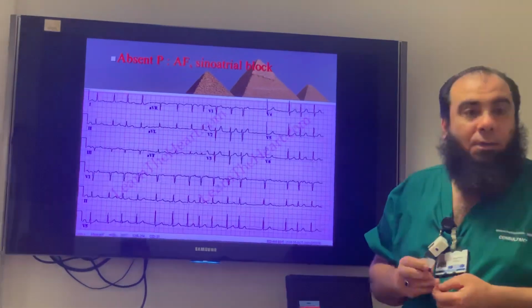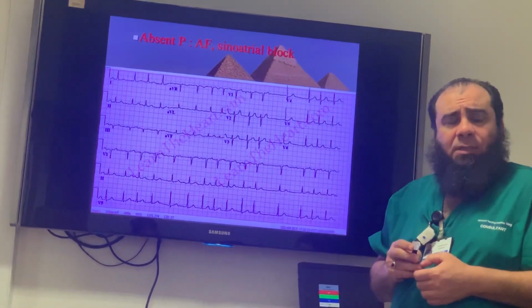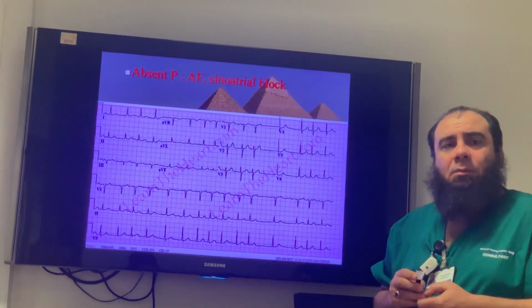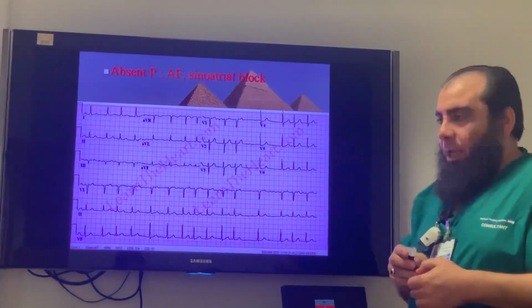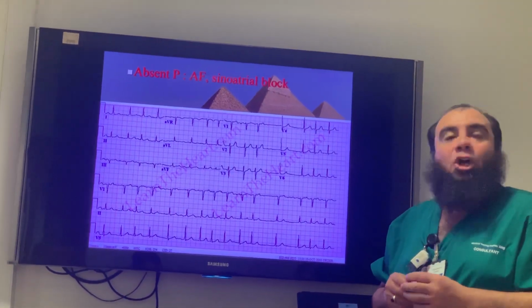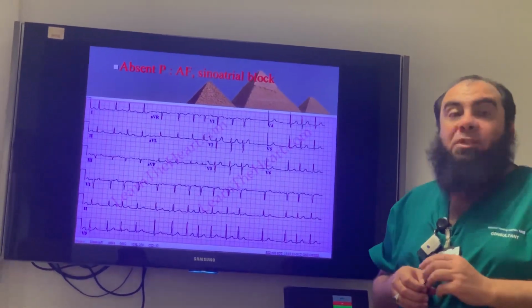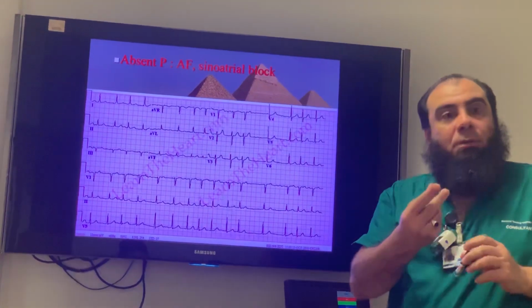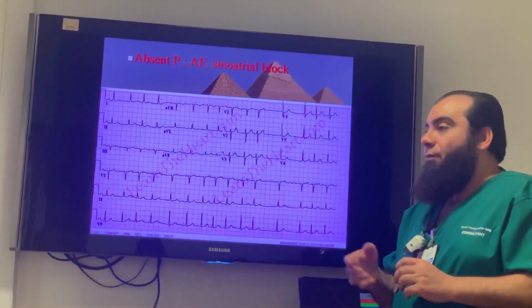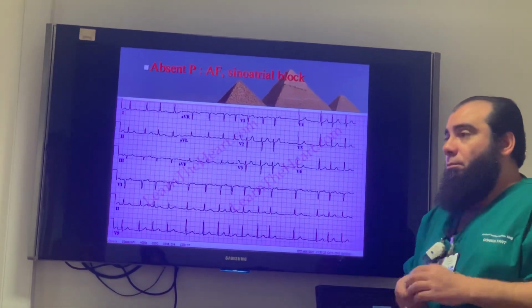AVNRT. Can you explain? AVNRT, atrioventricular nodal reentry tachycardia. Okay, nodal. AV node. Yeah, nodal, absolutely. Or we call it junctional, it is what we use. Junctional, absolutely. But you can find P wave sometimes, retrograde one. Sometimes, but basically no P wave. Ventricular rhythm. So junctional rhythm, ventricular rhythm. Okay?